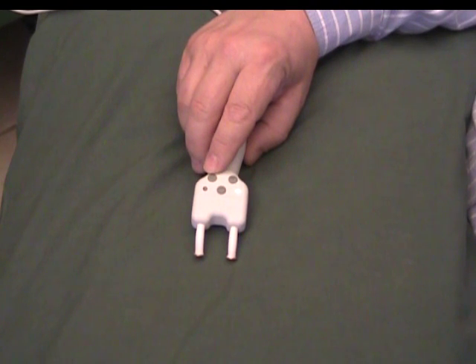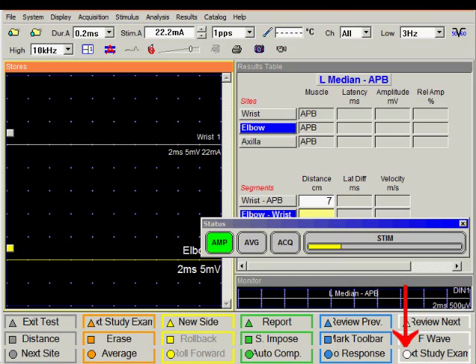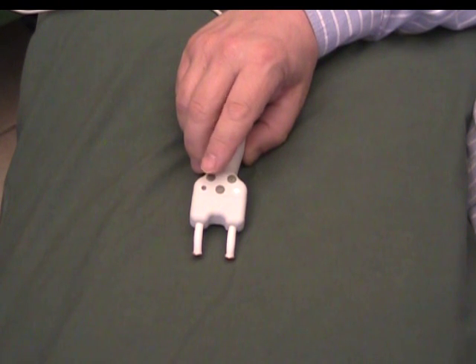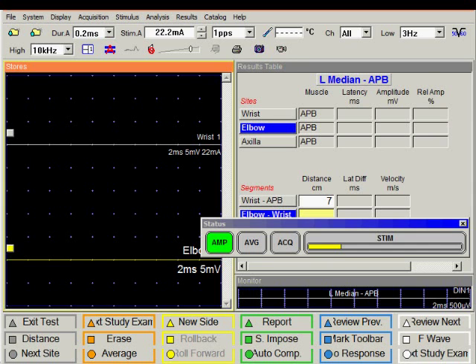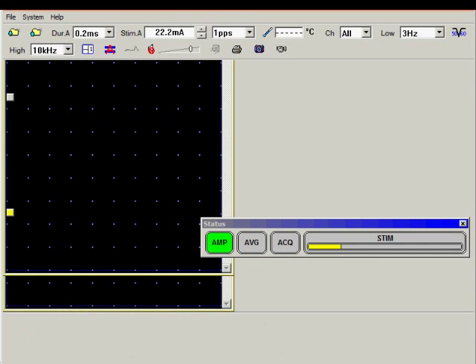This button has the same functionality as the white circle key next study exam. When using studies if I press this button it will clear the screen and get ready for the next examination in my study.